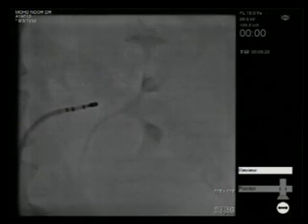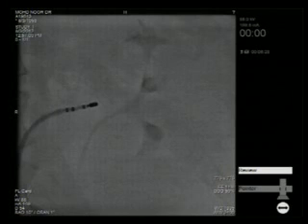Essentially, release the deflection. You decide the distal marker where you need to go off, and not go beyond the bifurcation. You can see the deflection is being released, and then he is going to torque the catheter clockwise, which will take it to the posterior pole. He is torquing the catheter now. Can you make a picture in picture, show his hands in a small picture, and have a fluoro?